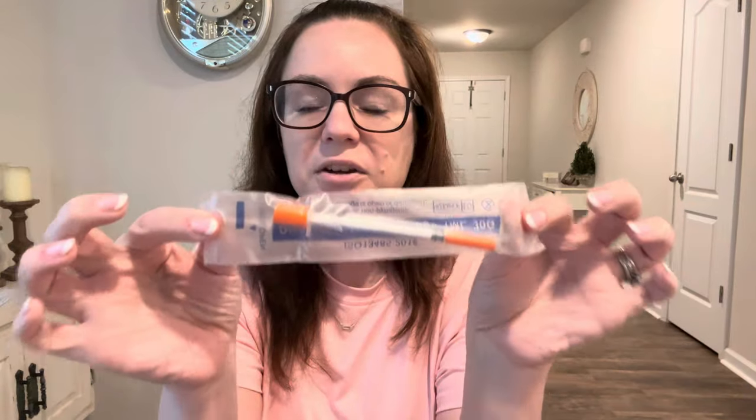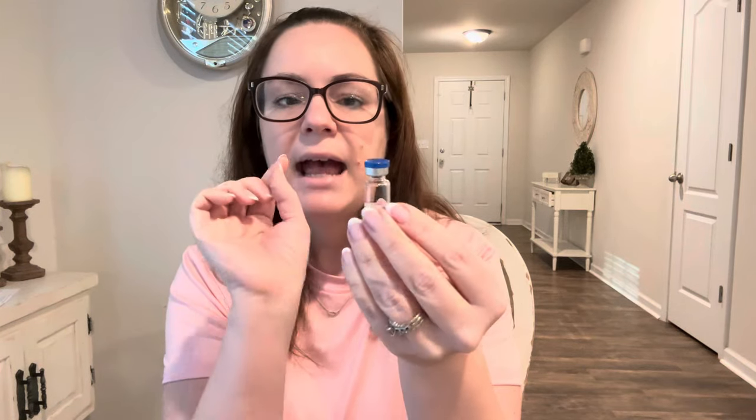Now you have three half-milliliter injections at five milligrams per half milliliter. It literally was that easy. Every time you are ready to do a shot, take one of your insulin syringes, alcohol-wipe the top of the vial, and draw up half a milliliter. On the insulin syringe — which is measured in units — you want to go to 50 units, which equals half a milliliter. Give yourself the shot the same way you do the Manjaro shots.